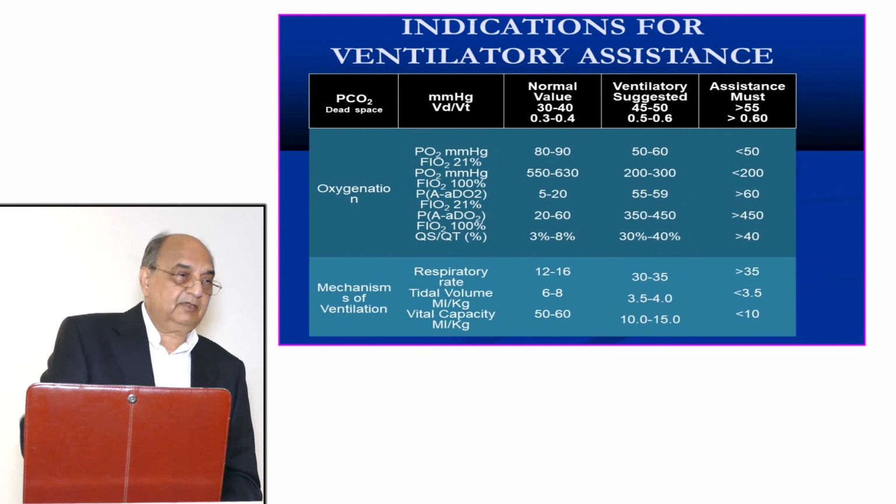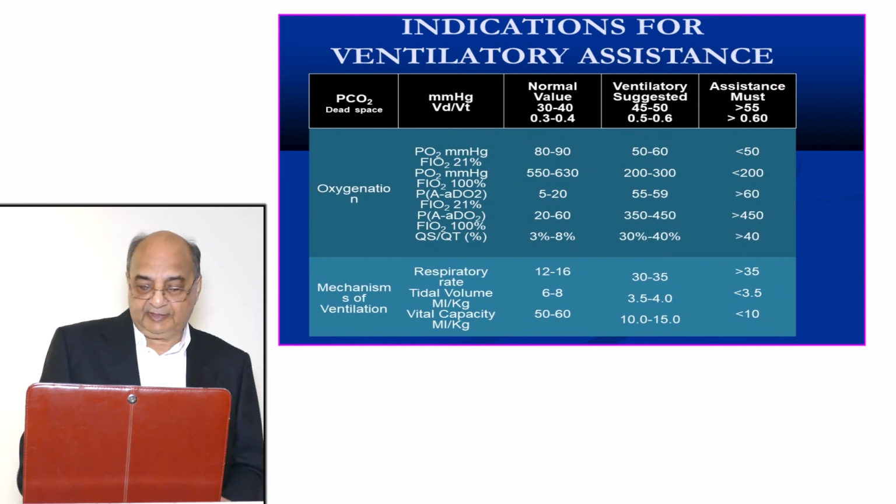So you have such a big list. It should be in your file. You look at that if the patient comes to you, whether the patient fits in that we should put the patient on a ventilator or not. Then you decide, you put the patient on a ventilator.